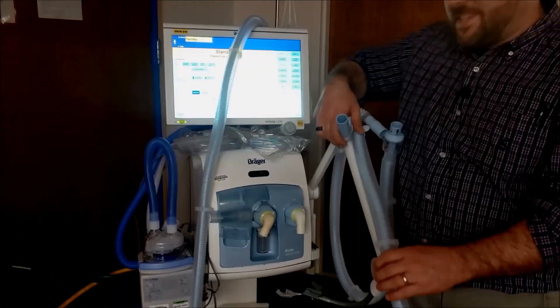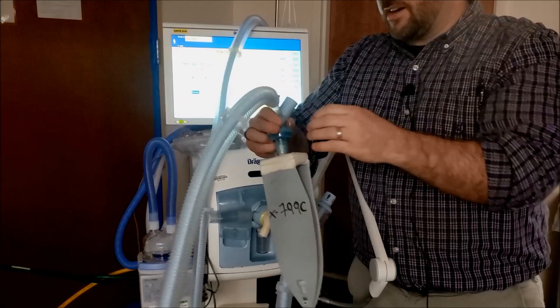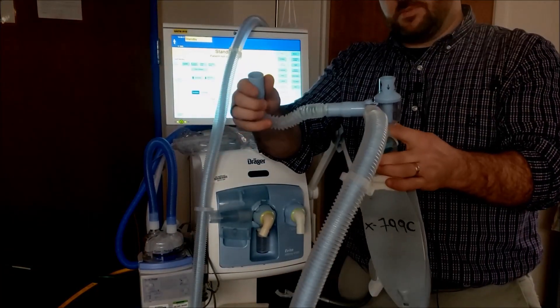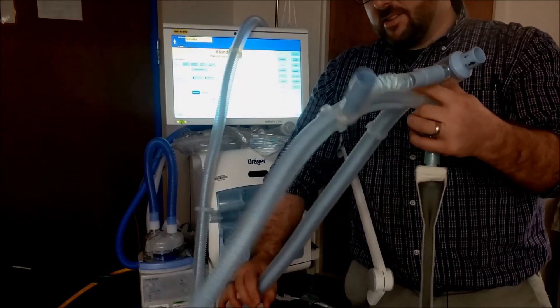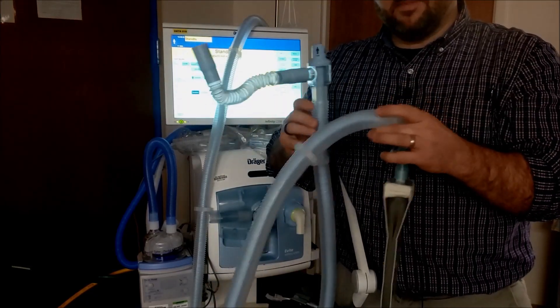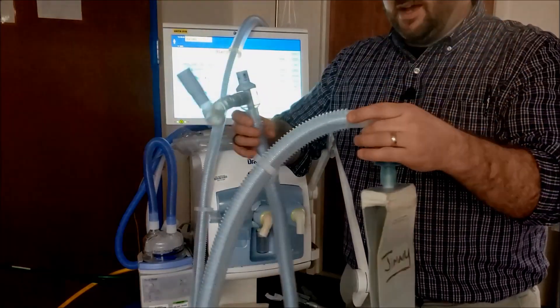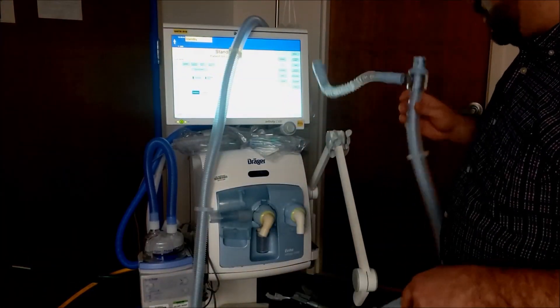I'm going to show you how to set this thing up. First thing you need is two vent circuits. These are Draeger coaxial vent circuits. They're pretty cool because you have inspiratory and expiratory. Inspiratory actually goes down the center to the patient. Expiratory comes on the outside and goes to this part right here. They work really well with HMEs and don't have a lot of extra bulk, since they're all packed into one. So that's the first aspect — we have two of those.